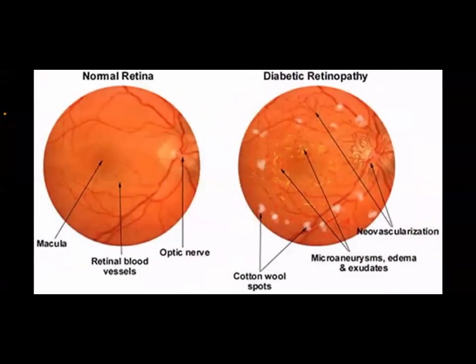We identified optic atrophy and papilledema. We came along the blood vessels: arteriovenous nicking, dots, some blots, some flame hemorrhages, hard and soft exudates, yellow and white exudate. Okay, then what else to look for? You should have a look on the retina if there is any small tree of vasculature, a lot of capillaries, a lot of small arteries, as if there is a tree here.